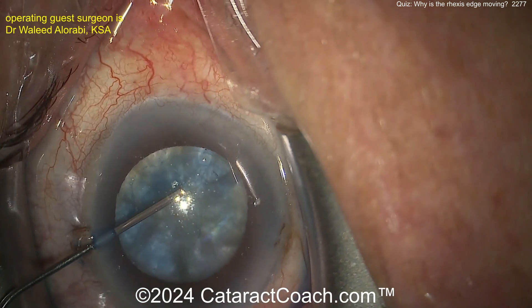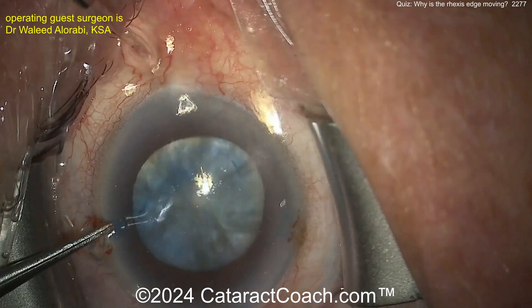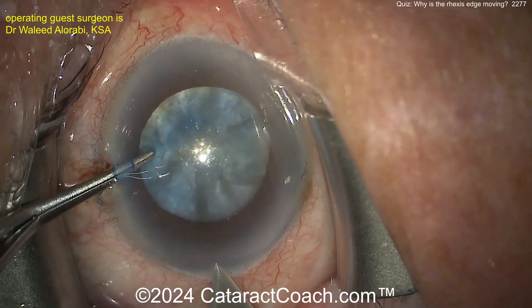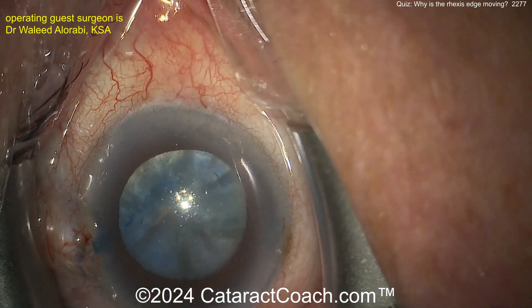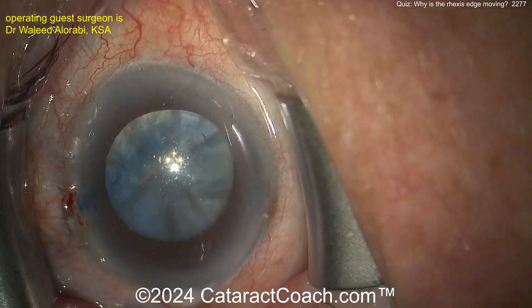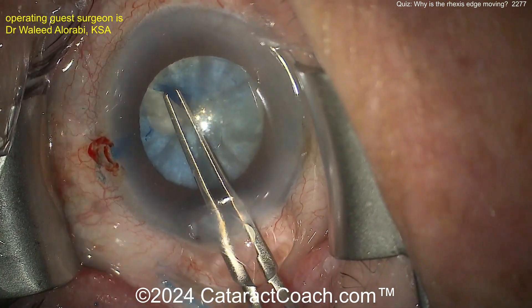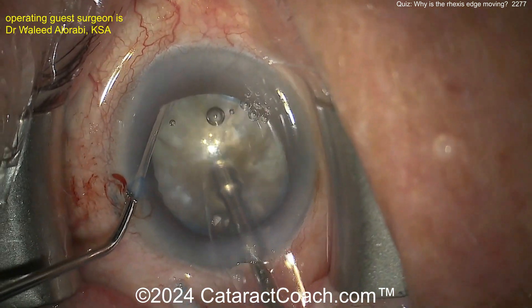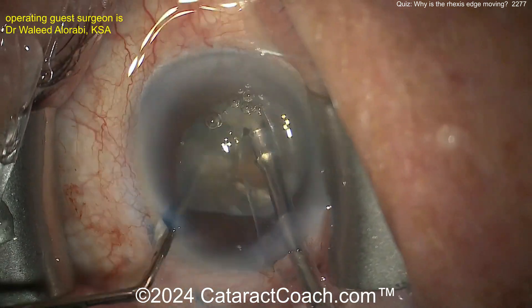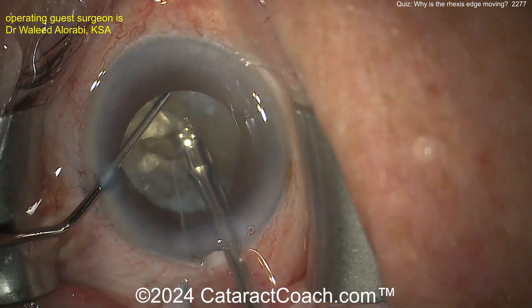Here's the main incision, that looks pretty good. Now holding the eye with forceps through the paracentesis. Here's the keratome poking in, and it looks like the keratome is also used to incise the lens capsule. The rhexis looks good — it's a normal rhexis creation. Think about why the rhexis was normal: the capsule wasn't wrinkly at all, everything seemed fine.